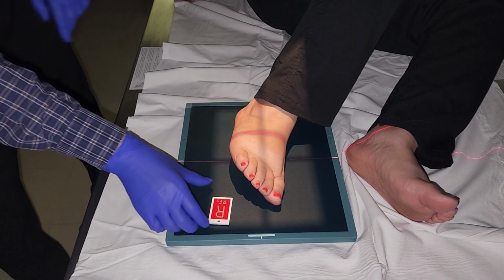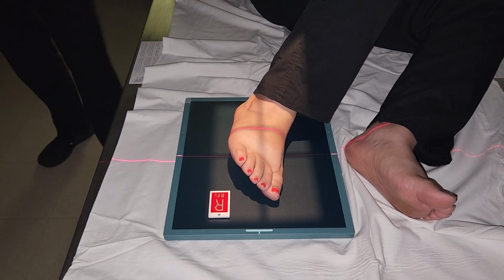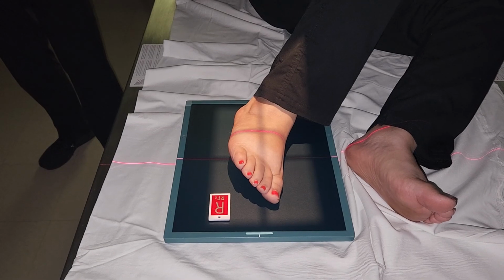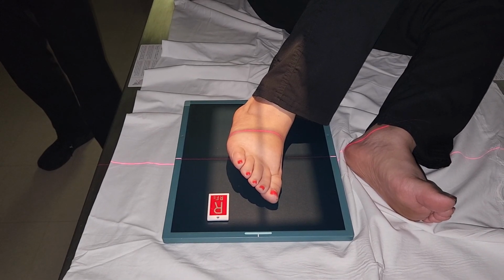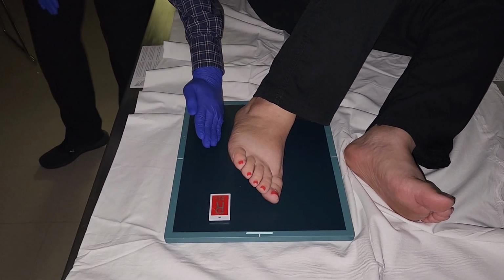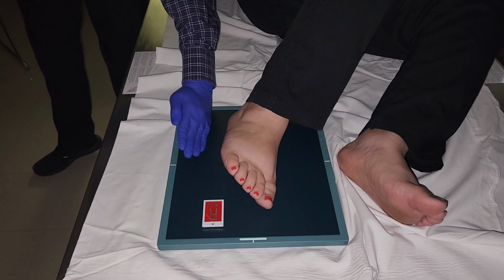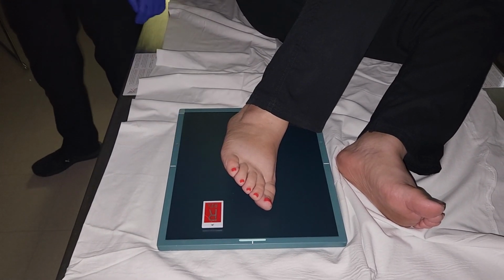Collimate, still centered at the base of the third metatarsal, and that is our oblique foot. We're looking at about 30 degrees from this side. So if this is flat, this is 30 degrees towards the medial side. 30, 45, 60, right?